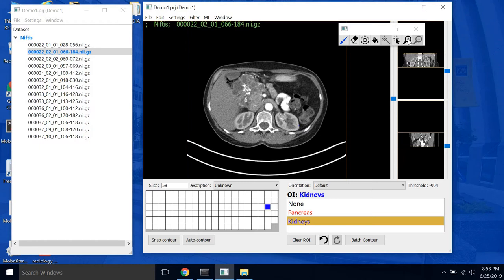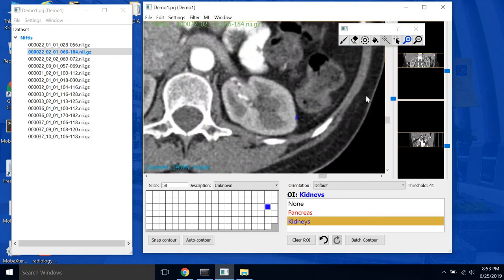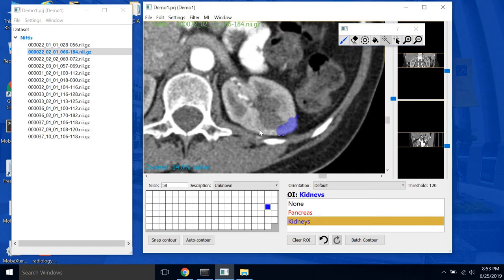To zoom in, to make it easier to see, on the paint toolbar here click the plus magnifying glass. Click and drag a box to zoom in. We'll switch back to our paintbrush tool and this makes it much easier to trace around the kidney.